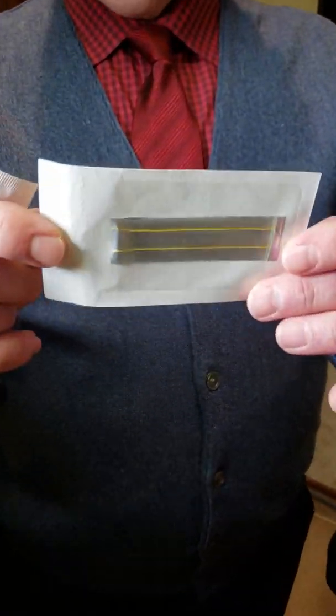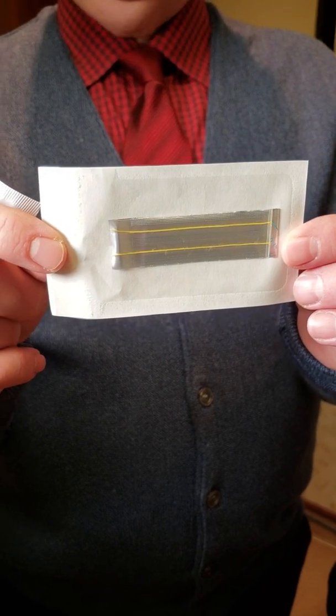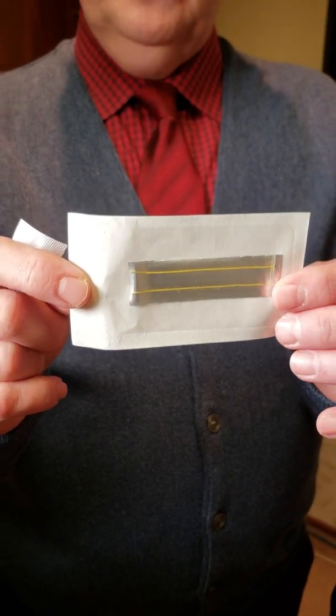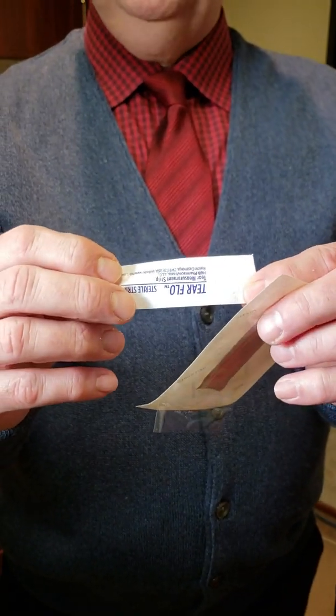The ZoneQuick test involves two yellow threads, and I'm going to place one of them over our patient's lid. It's only a 15-second test. The other one involves a strip of essentially filtered paper — that's a five-minute test. So what would you rather have: a 15-second test or a five-minute test? We prefer the 15-second test.